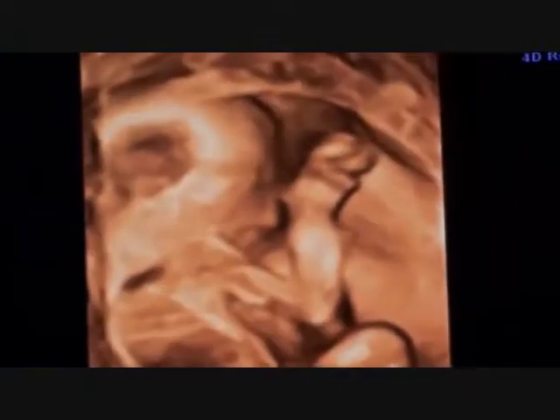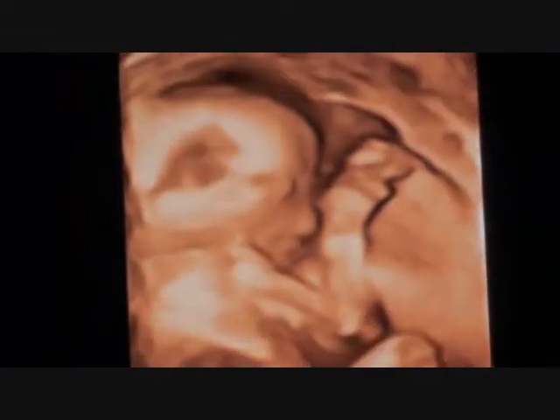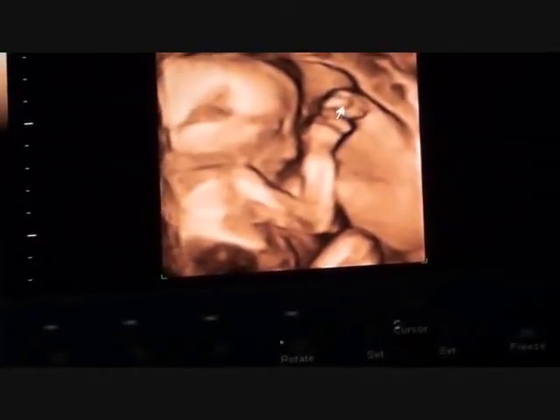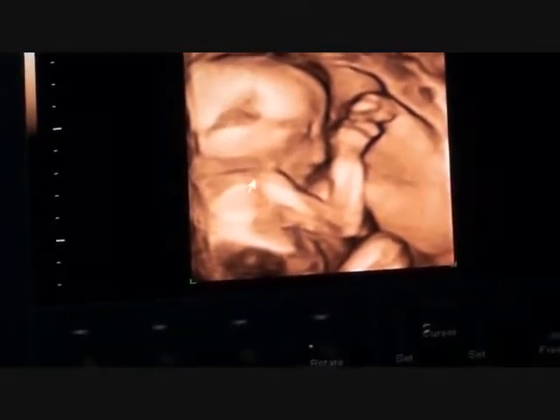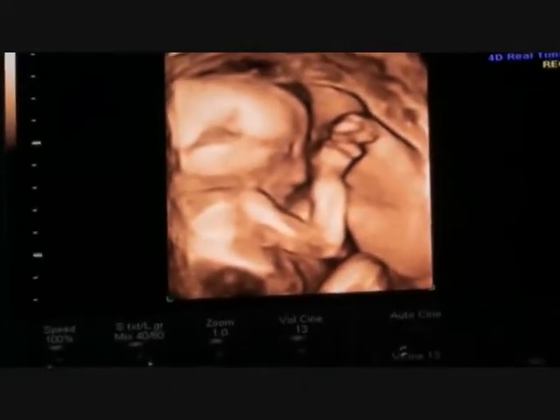Let's see if he'll give us some 4D. You did the 4D package. You see the little arm up by the profile? A little hand coming in — looks like our other little fist thumb. Another hand. A little knee, a little belly, a little shoulder, a little bit of the eye, a little bit of the nose and the mouth coming in back there. He looks a little bit more like a human every time — they start filling in each time a little better.